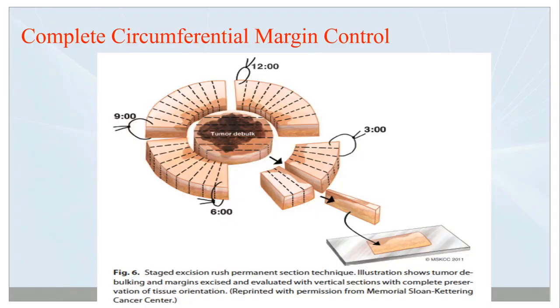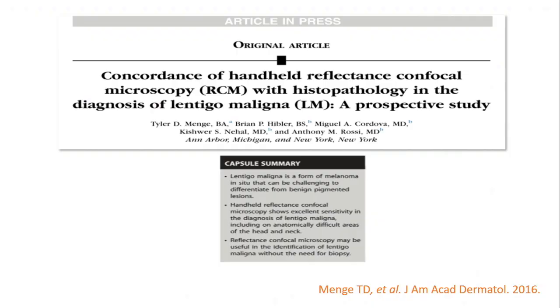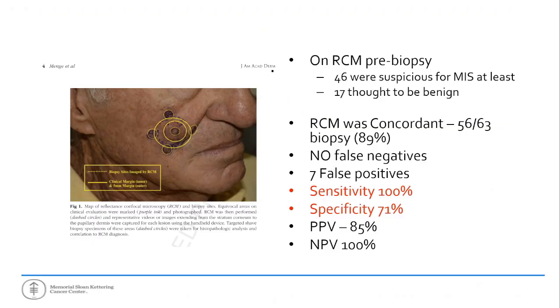And for us, seeing this technology translates to how we do things clinically. So, we're still surgeons, and surgically we need to cut things out. And so imaging in this manner and capturing these videos and translating them into panoramic blueprints of the skin, we're able to hone in on what margins we can take clinically and surgically to cut out skin cancer.